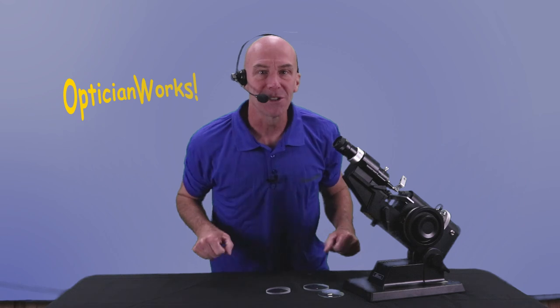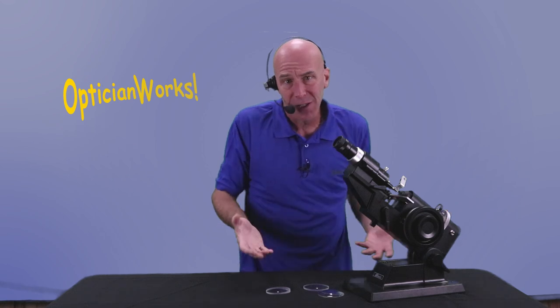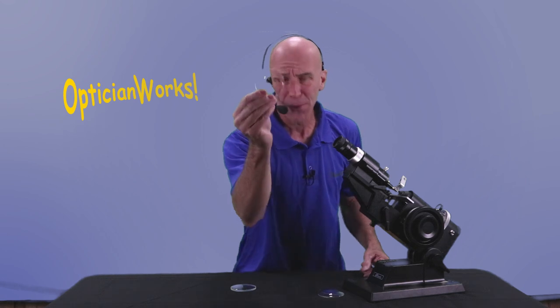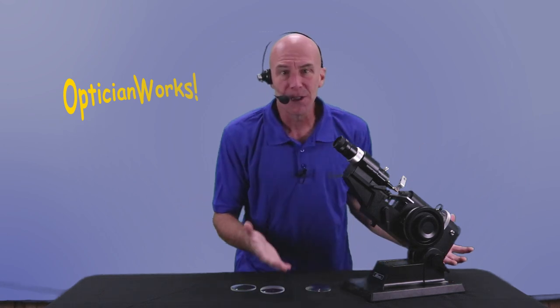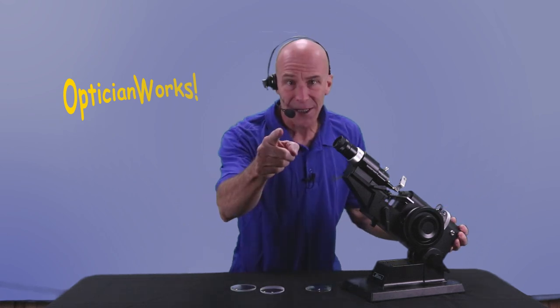John here from OpticianWorks.com. You're gonna be saying wow every time you use this lens meter. It's like a friend, it's like a co-worker, it's like an all-in-one toolbox. Single vision, of course. Line bifocals, bring them on. Progressives, go for it. Hey, it even runs on batteries. You can use this thing in your car. Made in Japan — you know they make good stuff. So act now.